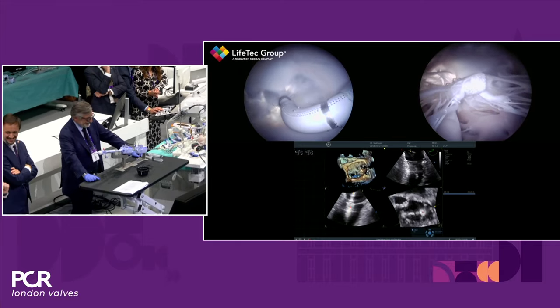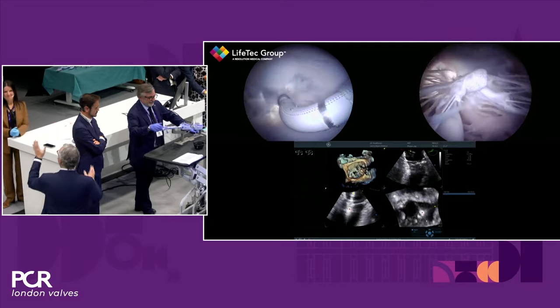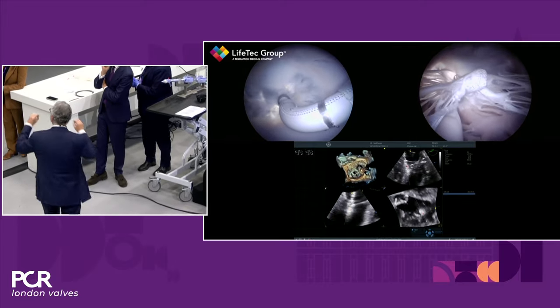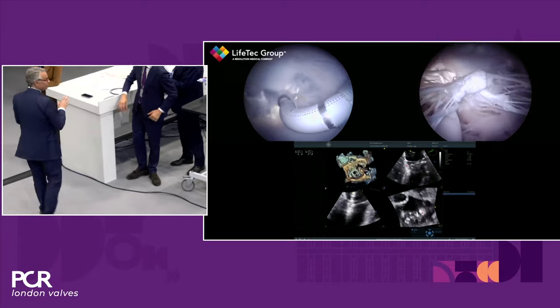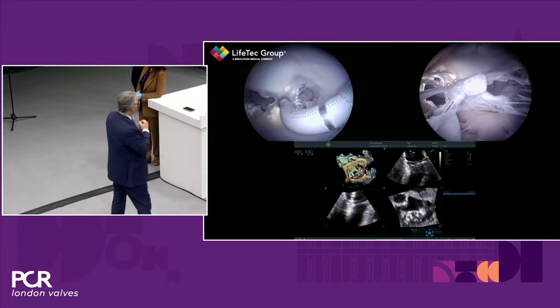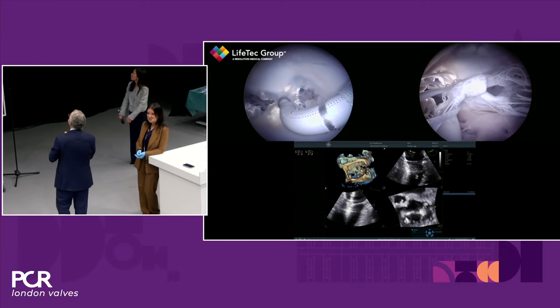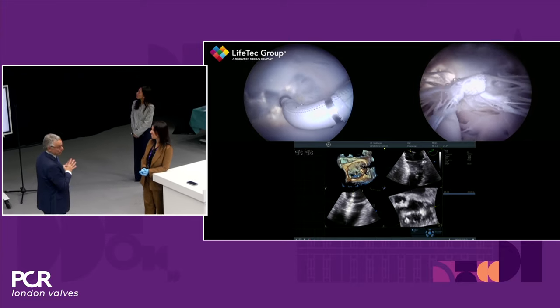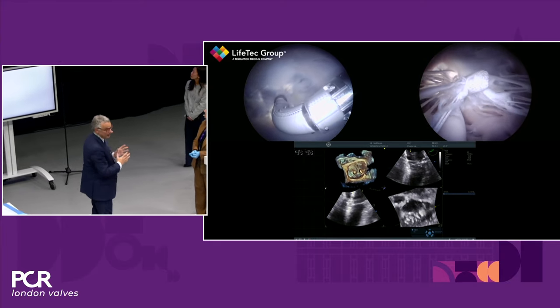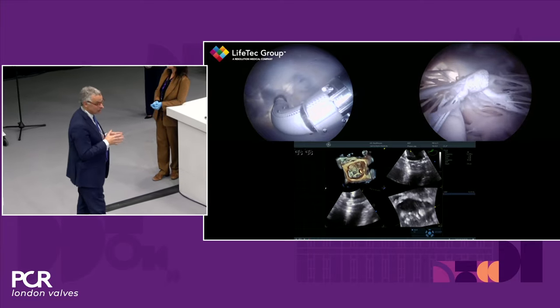Thank you so much. But what is beautiful about this live case, look at how the cords now are symmetric and the valve is opening and closing symmetrically. This is very important for efficacy, but also probably for durability of this repair. Now, what we see is a really nice leaflet insertion as well. Can you see how this clip is there and how the leaflets are incorporated? This is what we need to achieve.